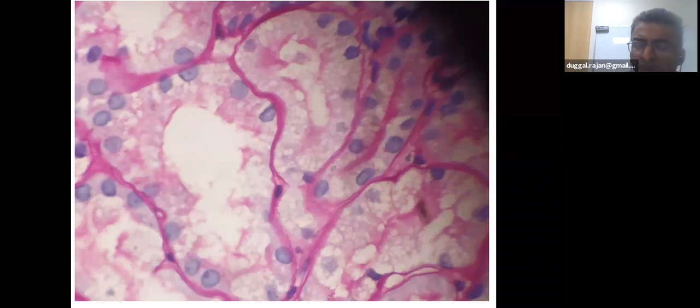And non-isometric vacuolizations, many times I write in my report also, you see commonly in electrolyte imbalances, mannitol infusions and all that. Osmotic diuresis, you can find those. So there was some kind of a vague vacuolization. There was a tubular injury which was mild, and there was a segmental sclerosis.